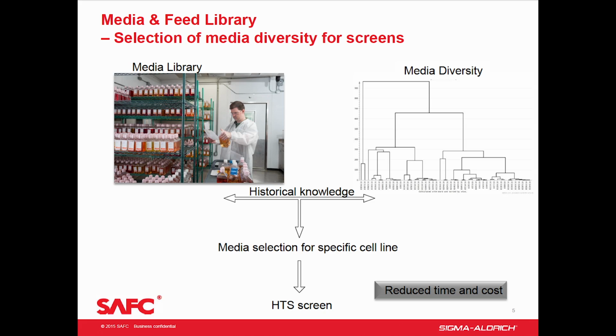So we have a very large media library in our house that, over the years, we've developed, figured out, and utilized for media and feed formulations for our customers. What we've been trying to do is analyze that media panel, and by using statistical analysis, mainly MVA, you can start looking at the media diversity within those formulations.